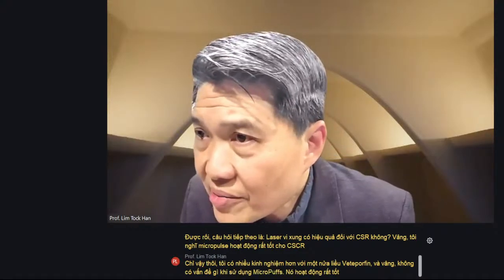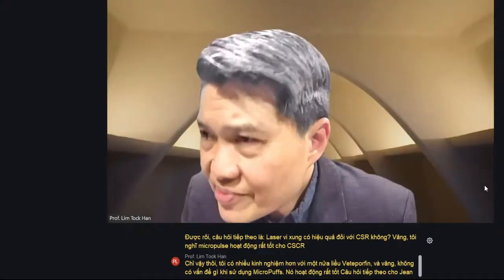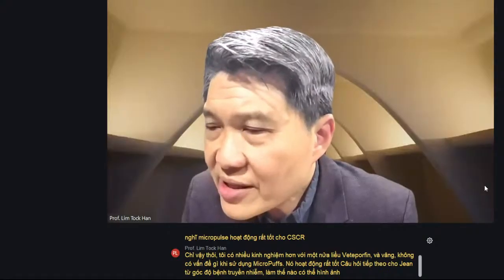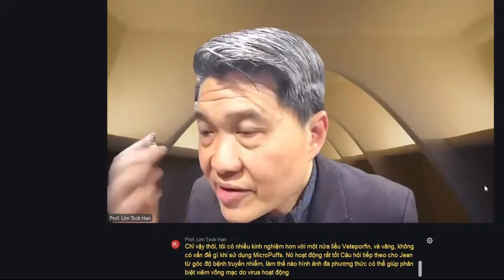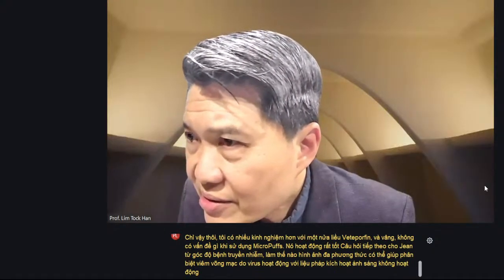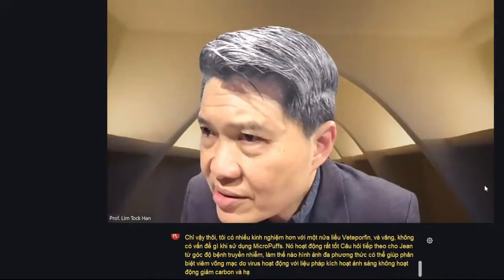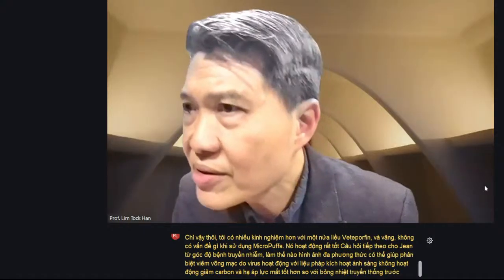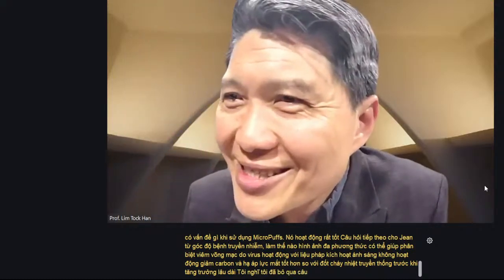Next question for Martin. From an infectious disease perspective, how can multimodal imaging help distinguish active viral retinitis from inactive... light-activated therapy, reduce scarring, and lower eye pressure better than traditional thermal burn in advanced long-term glaucoma? Oh, wrong. I think I must have skipped the question. Okay, I'll go back to Mahin, sorry.